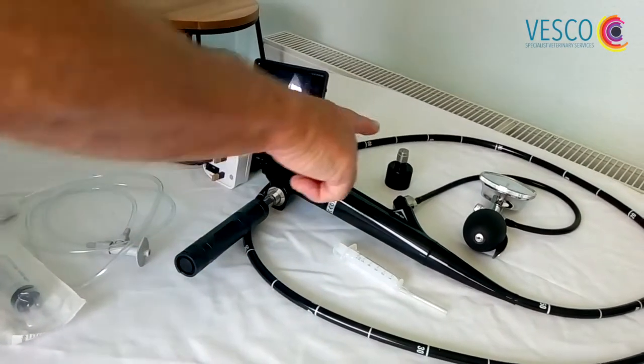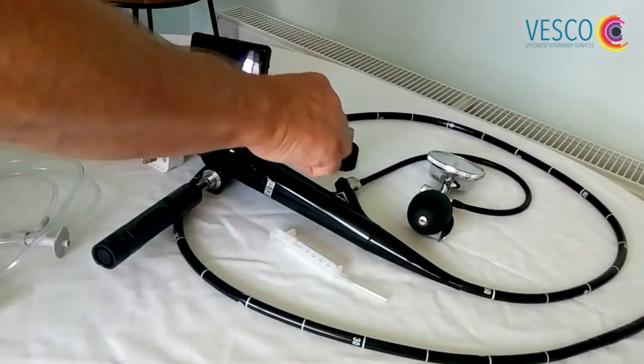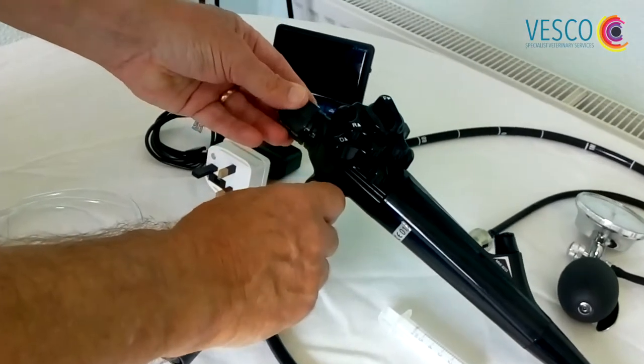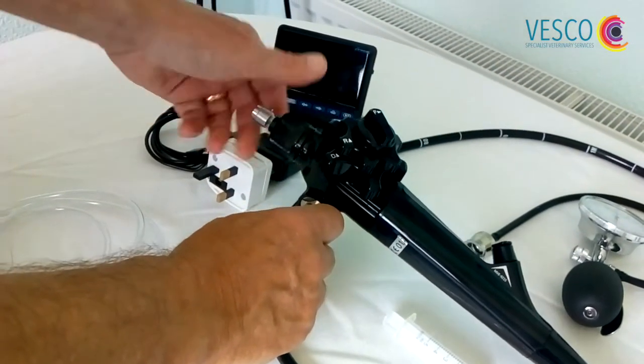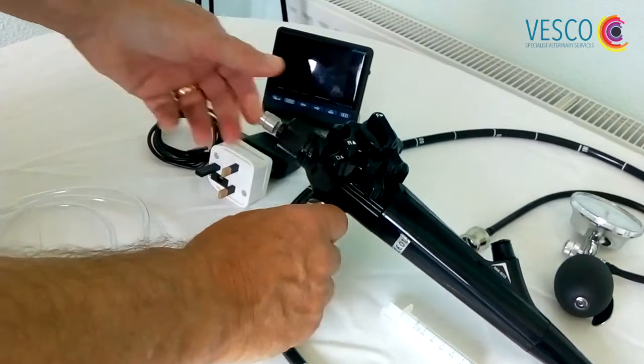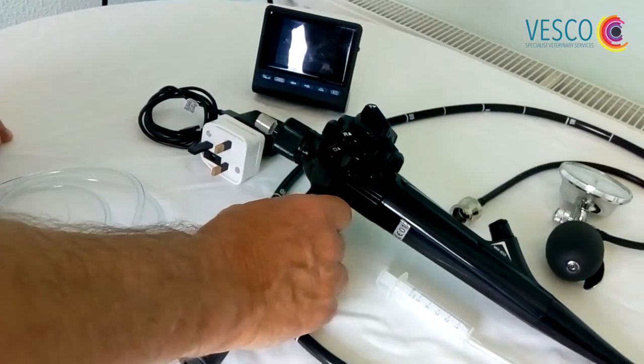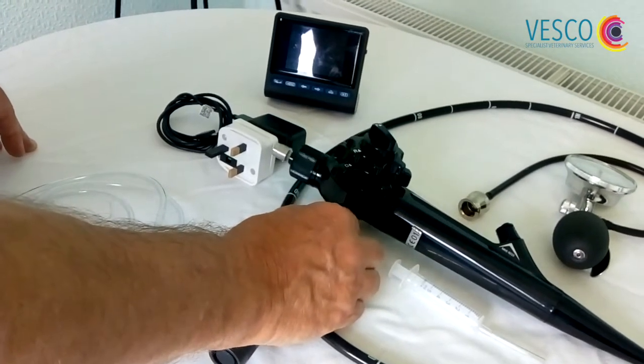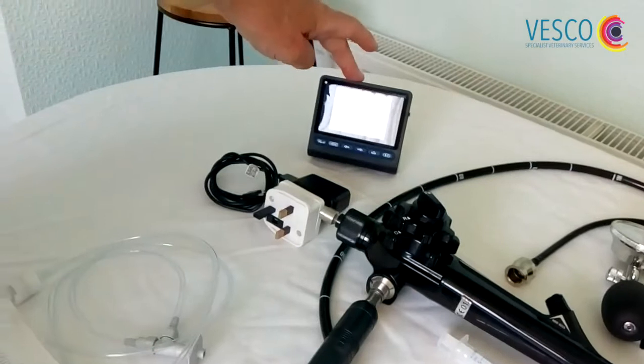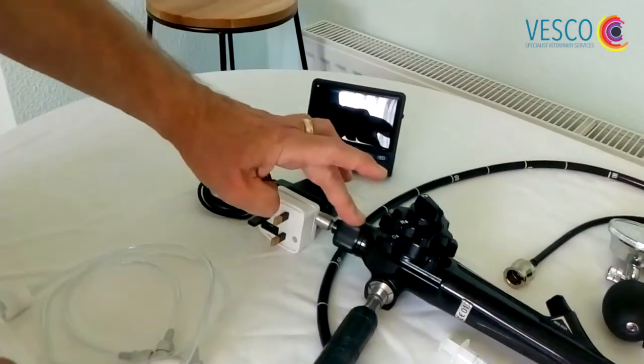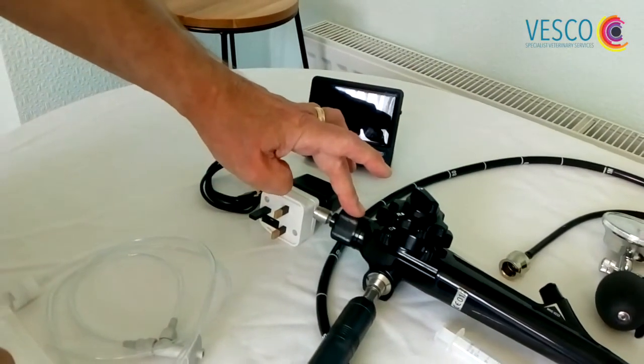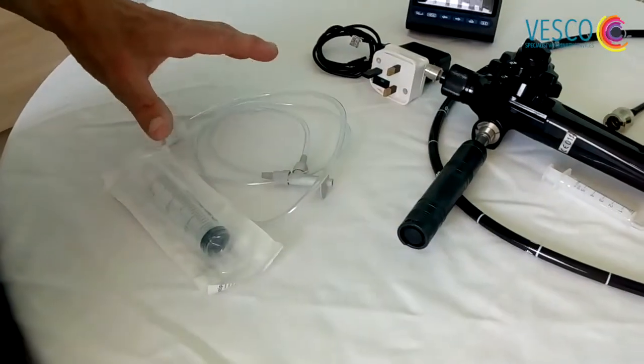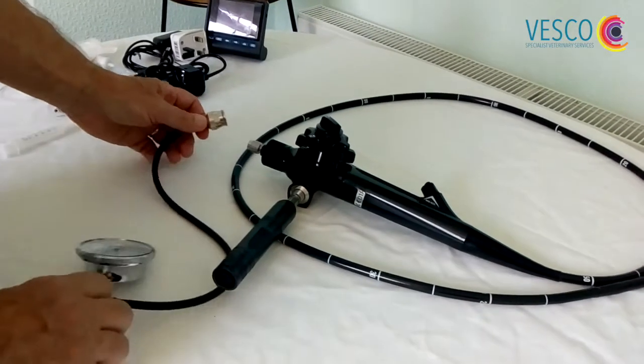We have the waterproof cap which screws onto here. This is for use in leak testing the scope prior to a procedure and also connecting to the scope post-procedure before we submerse it in any fluid. Here we have a small viewing screen which attaches to the end of the scope, and we have a cleaning kit here.